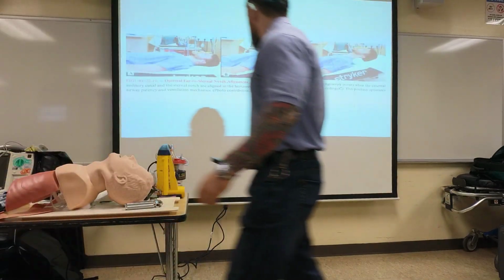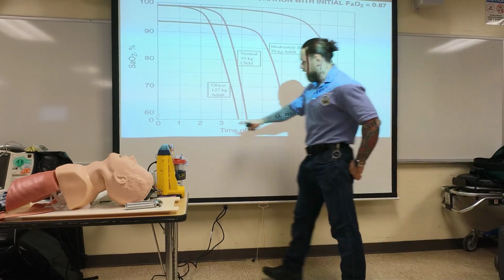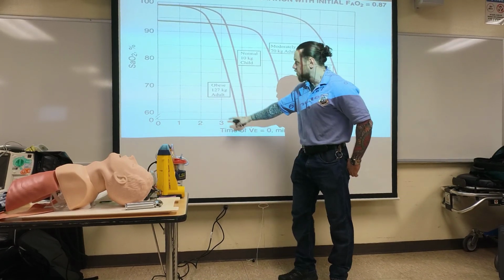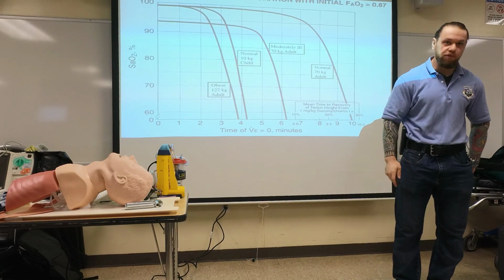Right? So now we know the time frames. So we're going to say their patients, if they pre-oxygenate right for 2 minutes, give them more than 30 seconds, right? Let's say you got this obese person, we'll give them 2 minutes. So you have 2 minutes as long as you do your technique right. If you don't do your technique right, yeah.